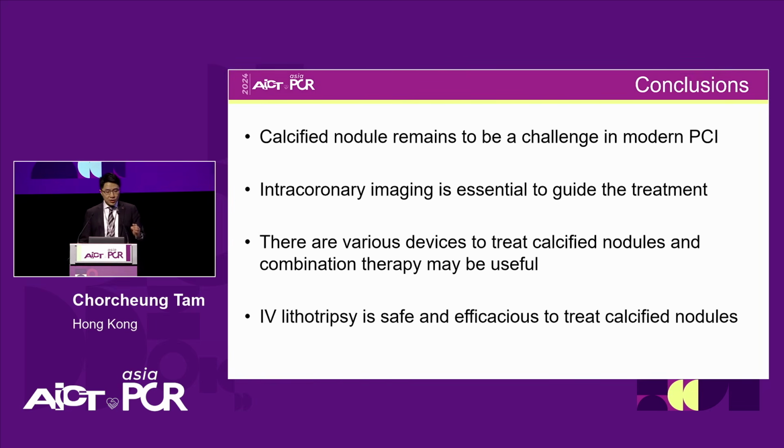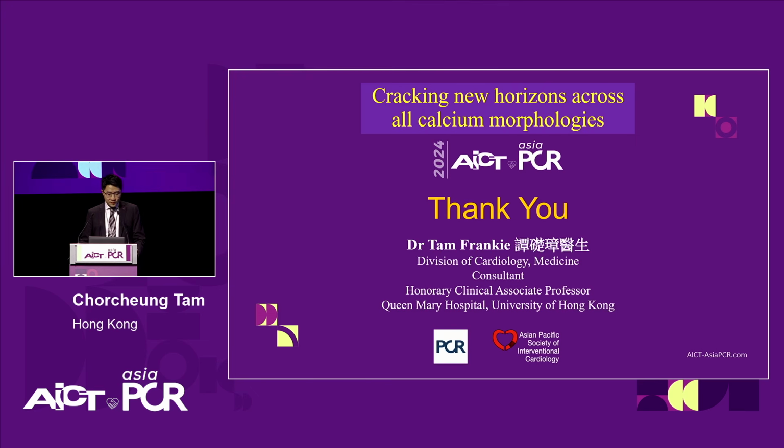So ladies and gentlemen, in conclusion, calcified nodules remain a challenge in modern PCI. Intracoronary imaging is essential to guide the treatment. There are various devices to treat calcified nodules, and combination therapy sometimes will be essential. Intravascular lithotripsy is safe and efficacious to treat calcified nodules. So thank you very much.